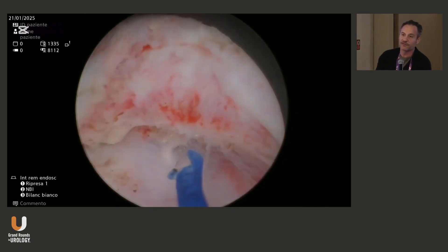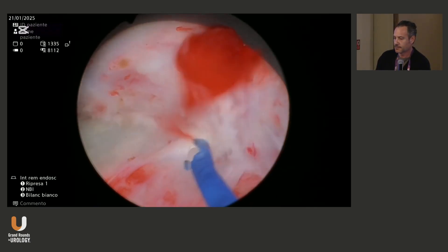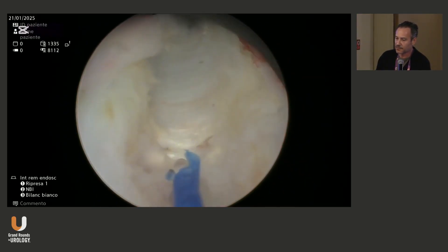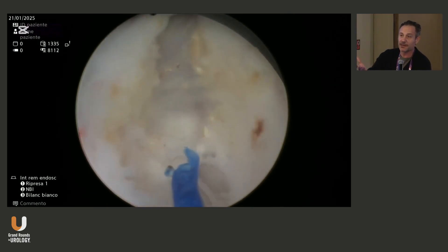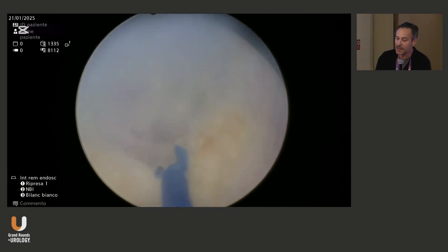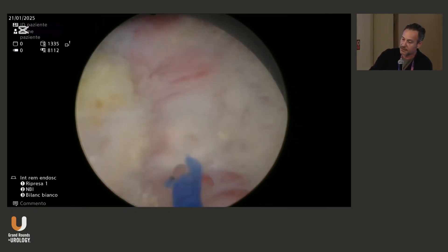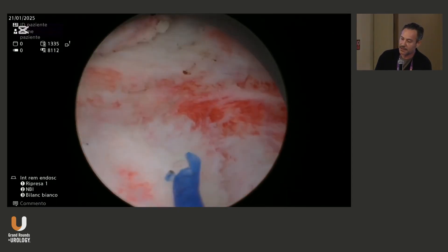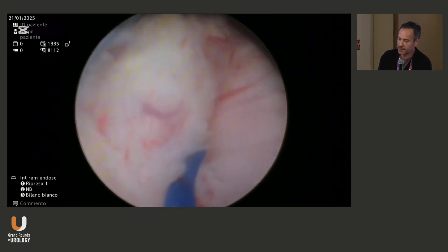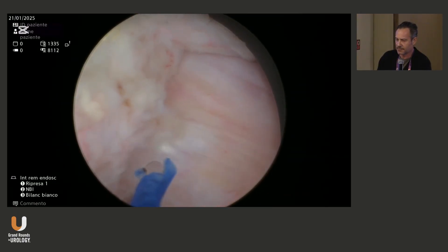The penetration of the holmium laser is 0.5 millimeters — in this case it's like nothing; you're just coagulating a small vessel. Then go back and try to identify the posterior plane on the midline. Once we cut, we will be able to find exactly where the posterior limit is. Now you see it's clearly visible — where is the right plane. We coagulate a little bit, and then once we reach the plane, we can gently move the prostate on both sides. The plane is always clear.